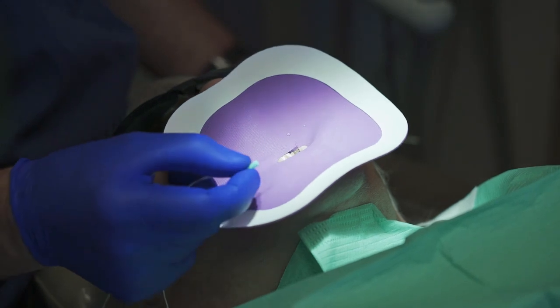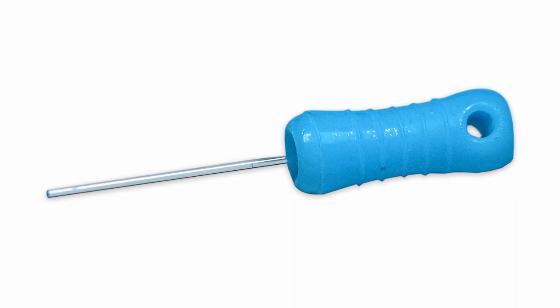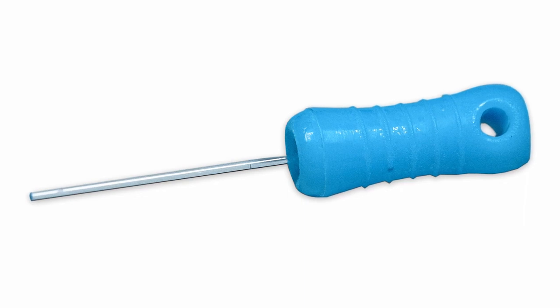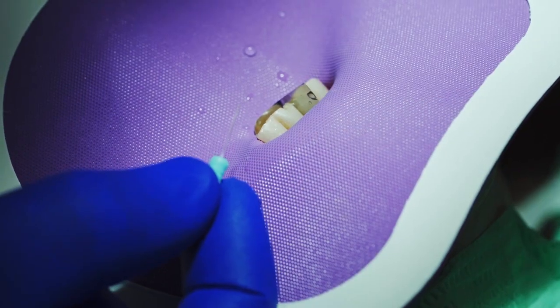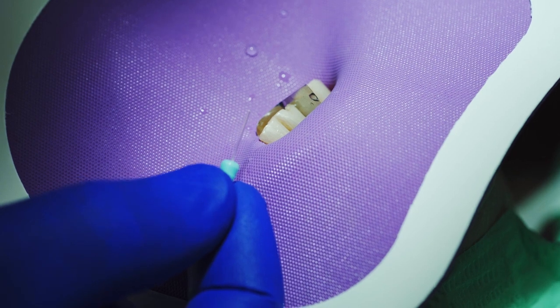We have developed this special fiber optic fiber designed specifically for this application. It has very similar properties to her natural tooth structure, so it will flex and move with her tooth. It supports the filling and anchors it to the tooth itself, giving us both mechanical and chemical retention.